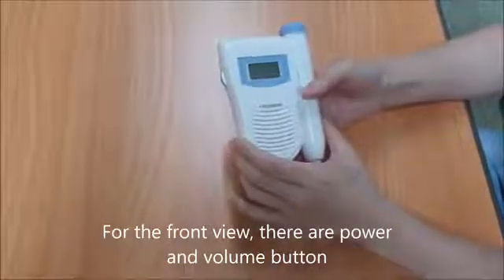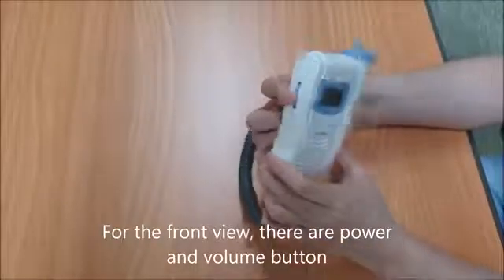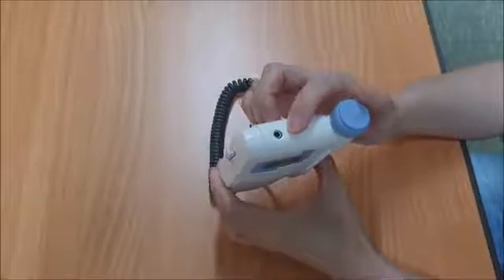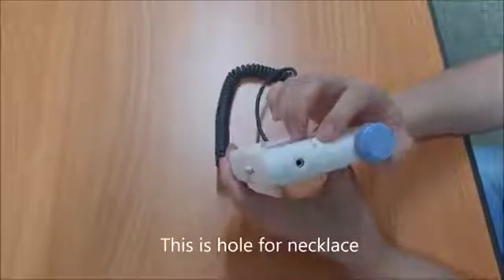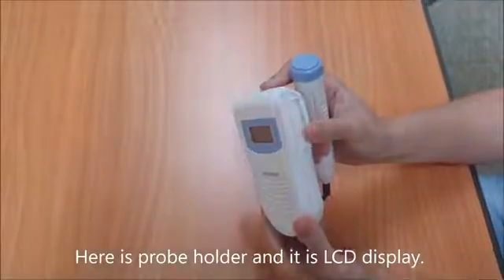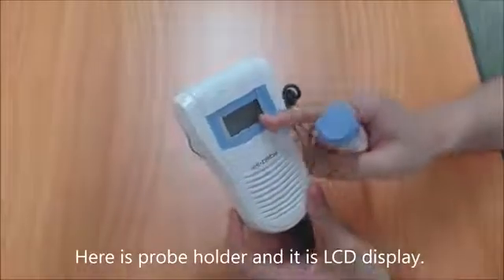For the front view, there are power and volume buttons here. And here is the earphone jack. This is the hole for the necklace. Here is the probe holder, and this is the LCD display.